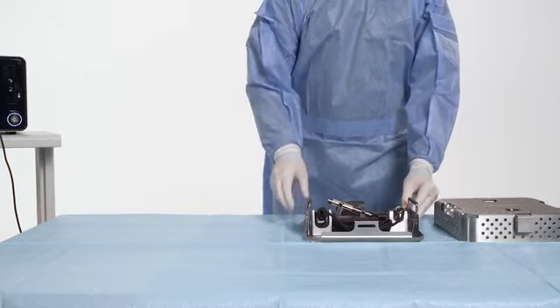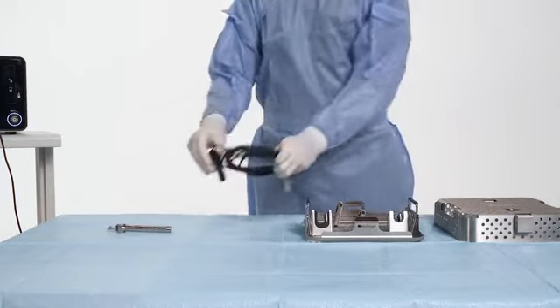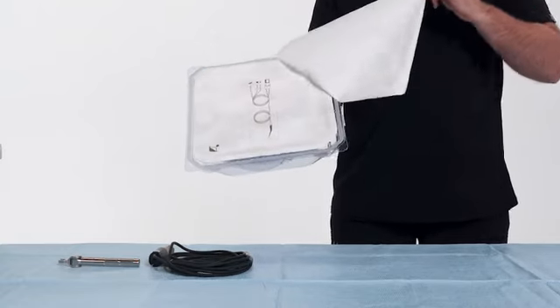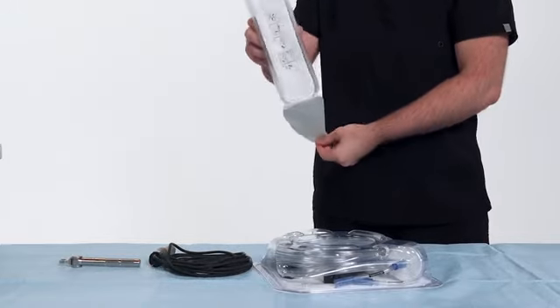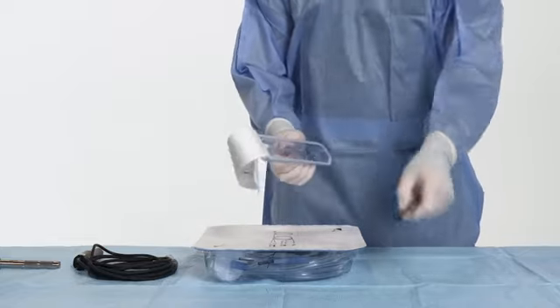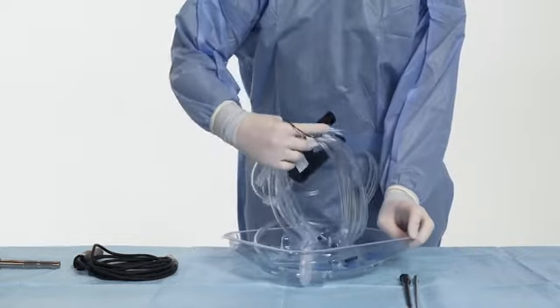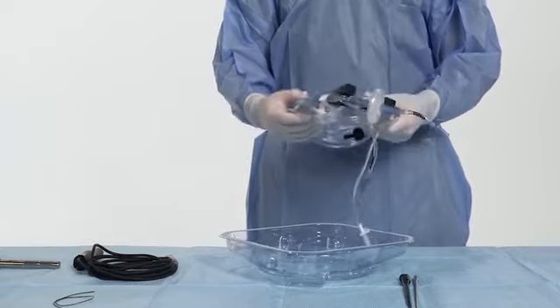Pass the handpiece, torque wrench, and sterilization tray onto the sterile field. Peel the outer package of the disposable items and transfer the inner package onto the sterile field. Peel back the inner package and remove the tip, sleeve, and cassette from their packaging. Remove the black disposable cleaning wire and place on the sterile field for potential use during the procedure.